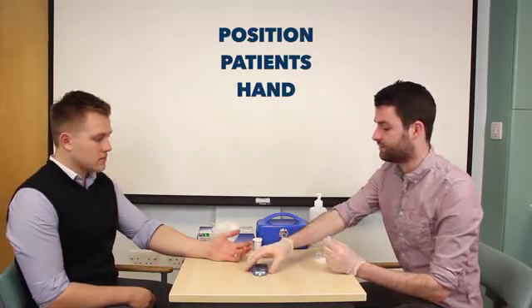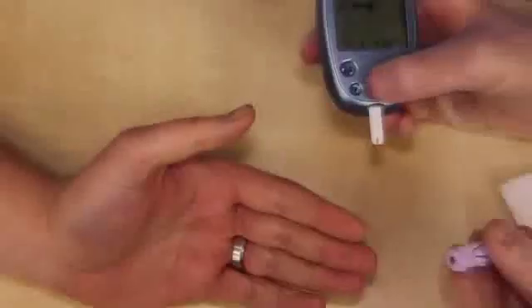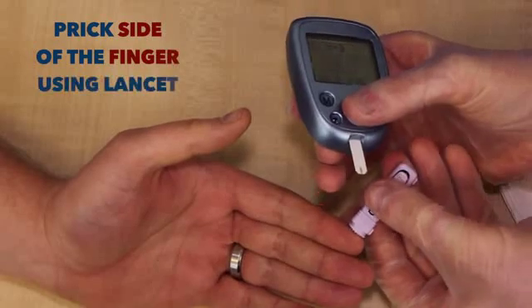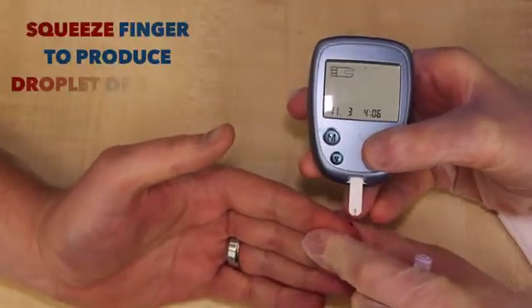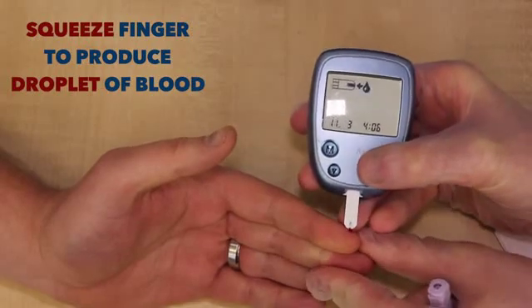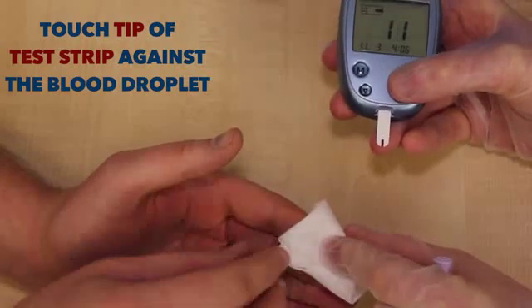If you could just put your hand on the table for me. I'm going to take the blood sample now, so you might feel a sharp scratch. Okay. Sharp scratch. Just pinch your finger together for me.